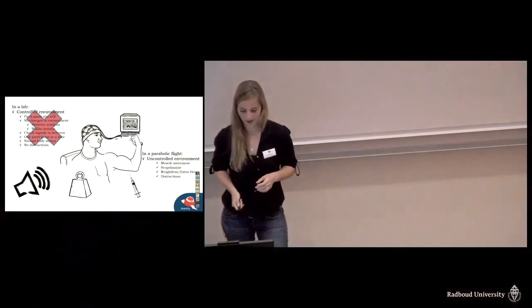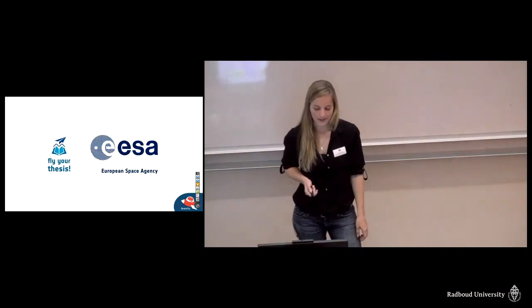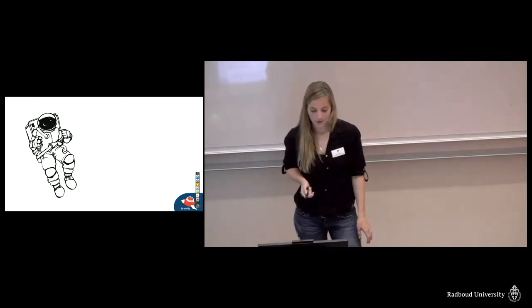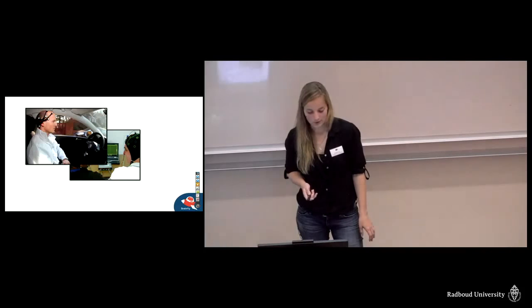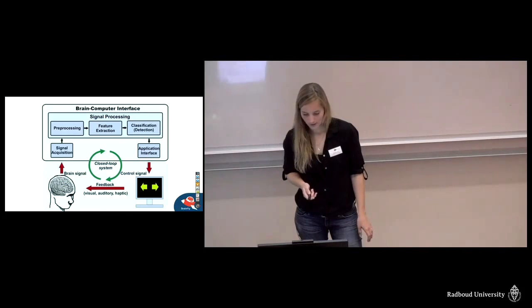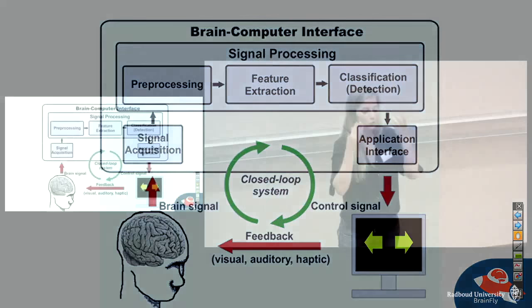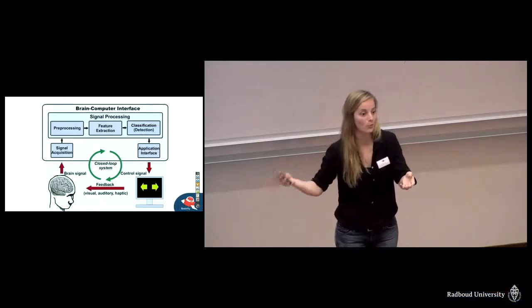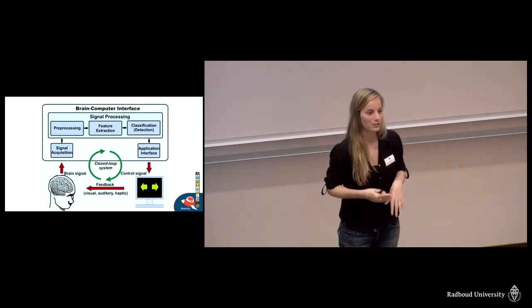They were mostly trained for the BCI, yes, to have it controlled, because the brain also adapts to what it sees. So for example, you learn to control your brain the way that the program wants it, but the program also adapts to your brain signal. So it's basically a two-way street.